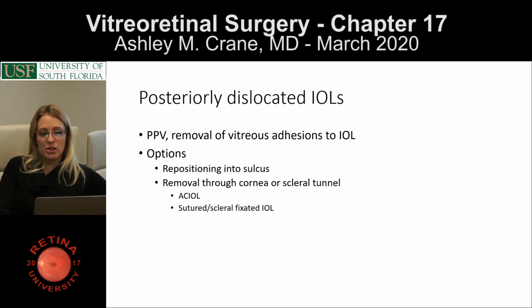Options include repositioning into the sulcus. I've seen that happen if you have a 3-piece in the bag and it falls through, and you can get it into the AC and put it in the sulcus.